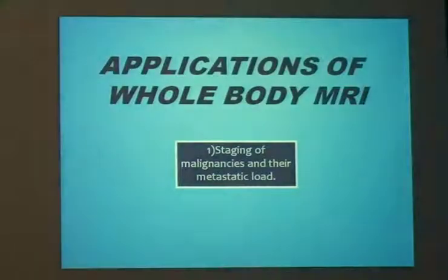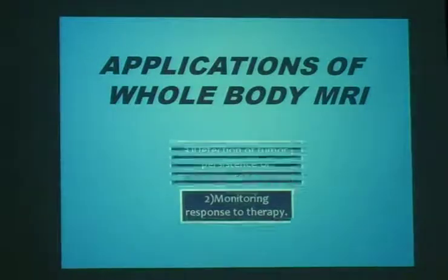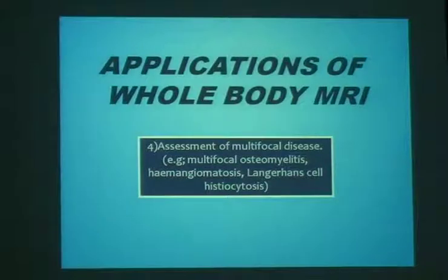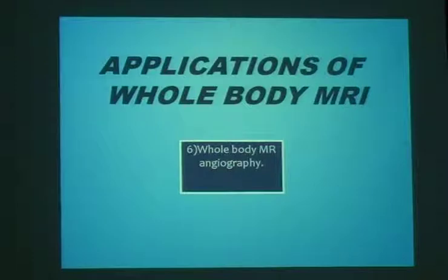the soft tissue, osseous, and nodal metastatic load, monitoring response to therapy, and detection of tumor persistence or recurrence in comparison to benign post-surgical therapeutic changes. Also, assessment of multifocal disease in settings other than malignancy, like multifocal osteomyelitis, multiple hemangioma, and Langerhans cell histiocytosis with multi-body affection. There is also the whole body MR neurography I showed in the previous presentation, and whole body MR angiography.